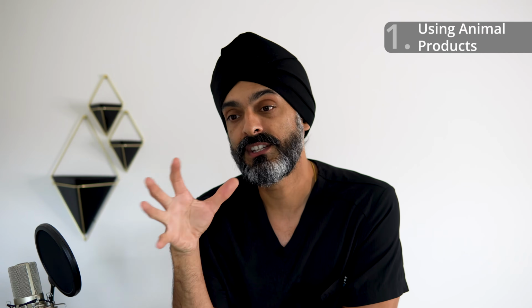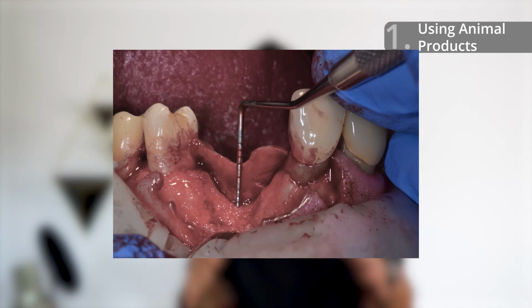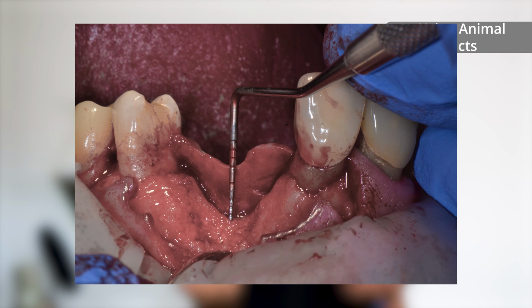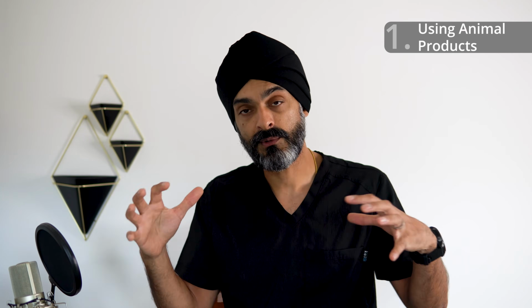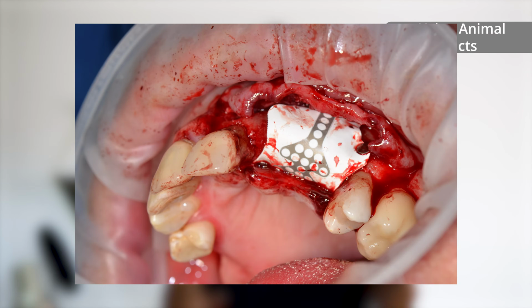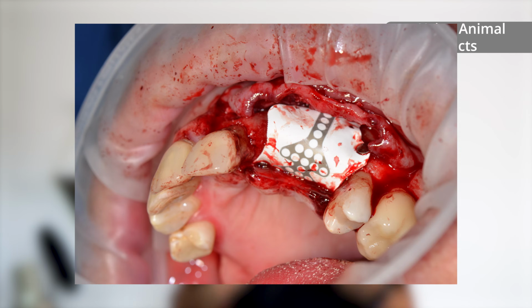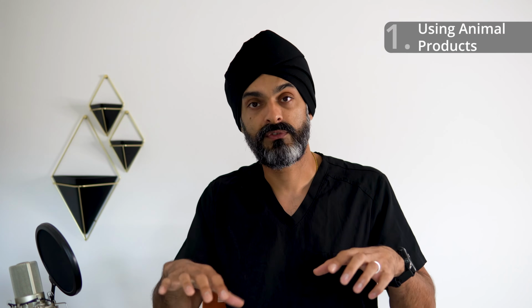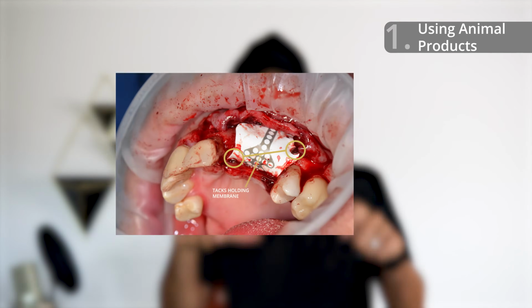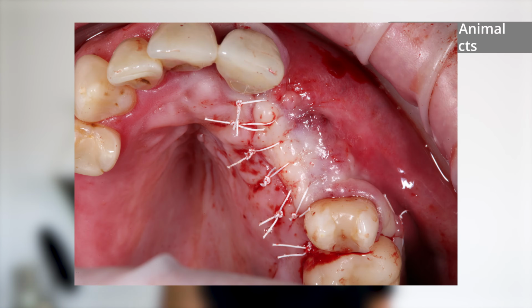Now the way we use this stuff is we put it on the bone. So usually we open up the bone and there's kind of a hole or a defect, as we call it, which needs filling up with bone. So we'll pack this kind of sand product onto this bone, and then we'll put a membrane on there, which ultimately comes from pigs usually. And we'll put this membrane over the top of it and tack it in position. When I say tack, we use tiny little drawing pins just to hold it in position. And then we close the gum over the top.